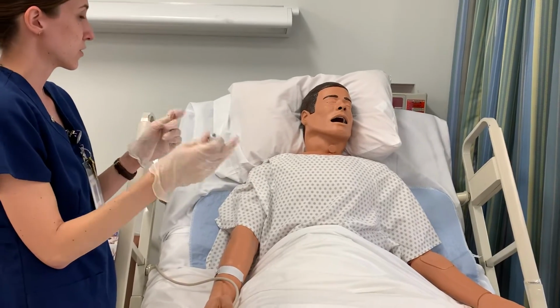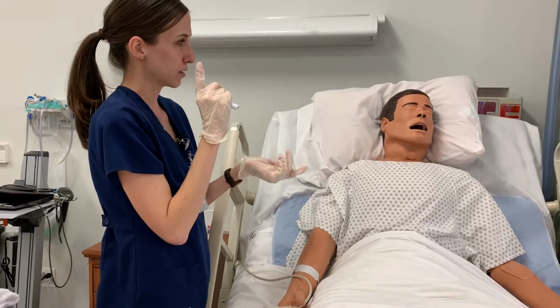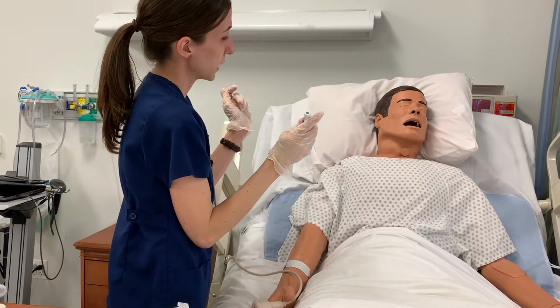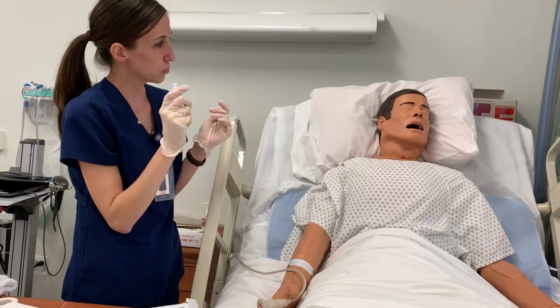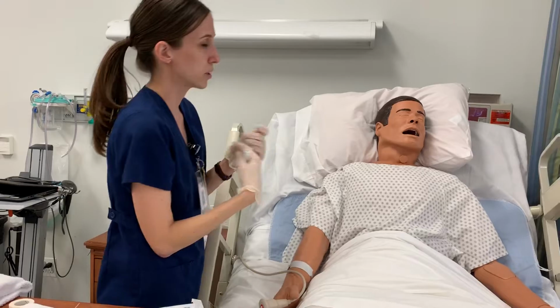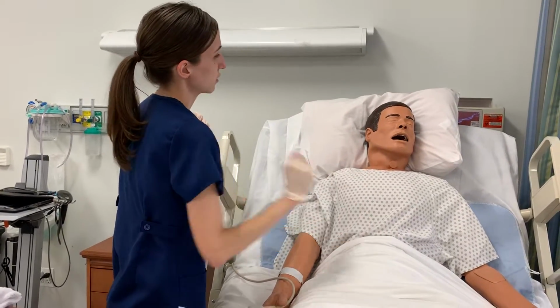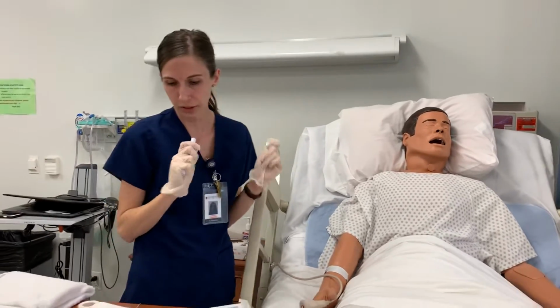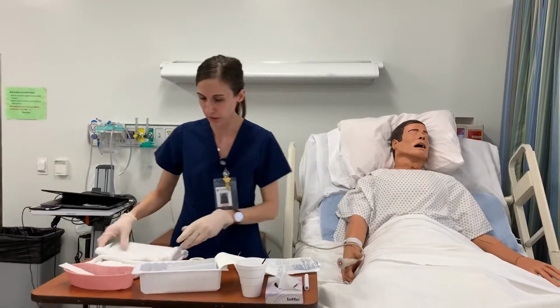I'd also like to assess for the patency of your nares, so I'm going to ask you to just hold one nostril and occlude it and take a breath in, and then do that to the other one. So both nares are patent, so again, patency noted bilaterally. I'm also going to be assessing for my client's gag reflex, so I would use a tongue depressor and place that in the back of their mouth and note that gag reflex. I also take my stethoscope and auscultate their lung sounds and their bowel sounds as well. Let's see, that should be good. And I'm going to place this to the side, but make sure it's readily available for me.